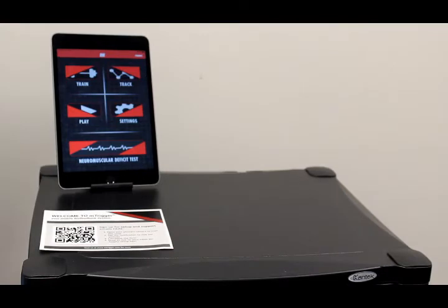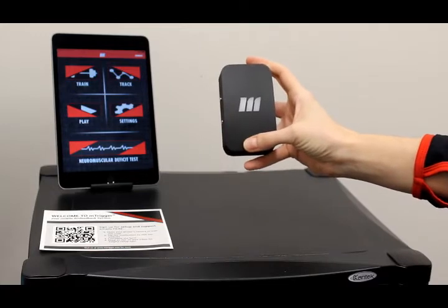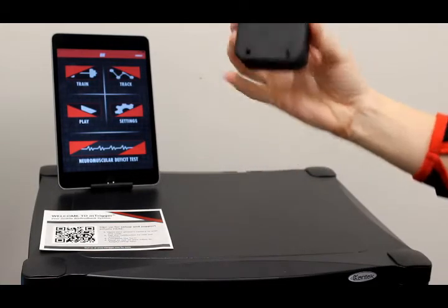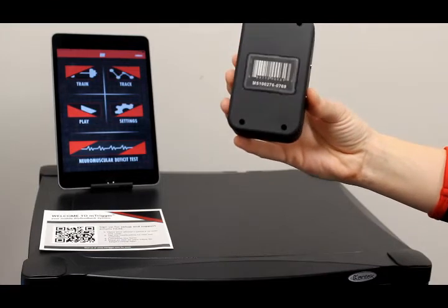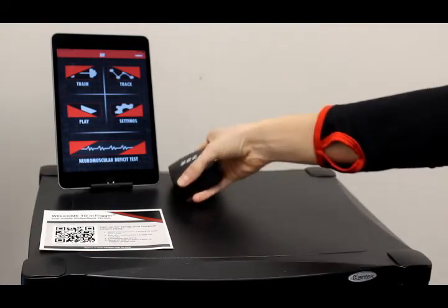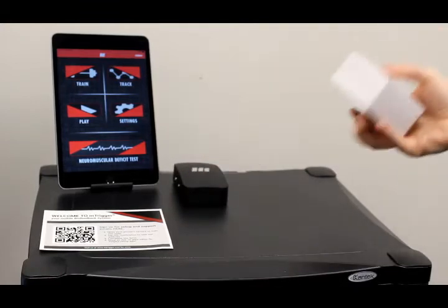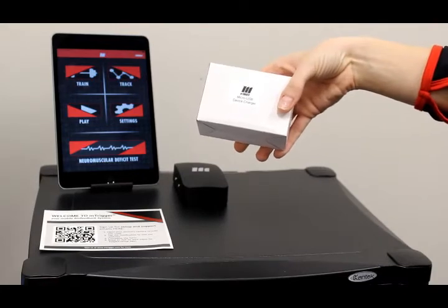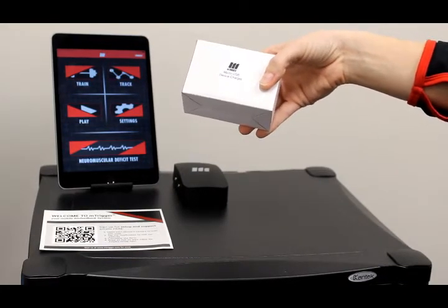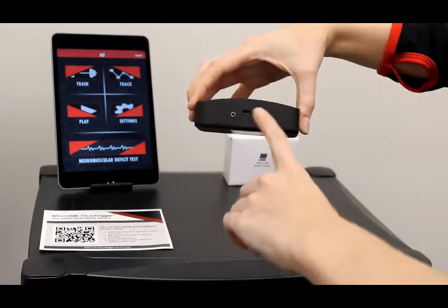The first thing you'll find is your mTrigger unit itself, and that is the main hardware and electronic component of the system. You can see the serial number on the back, which we'll get into later how that relates to Bluetooth. You'll also find a charger for your mTrigger device in this box — that is a micro USB standard charger — because the unit itself is rechargeable via the port on the side.